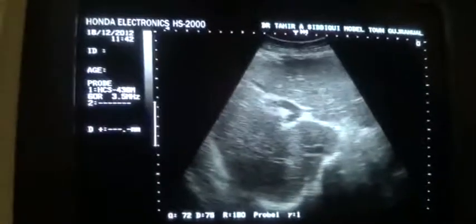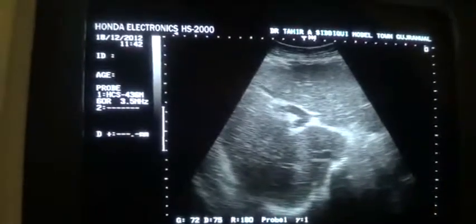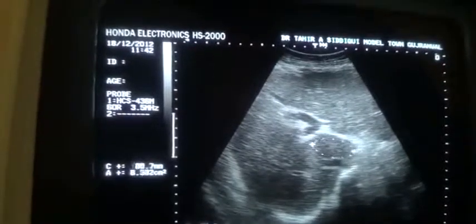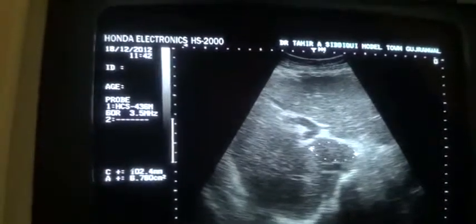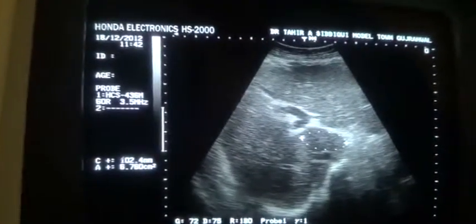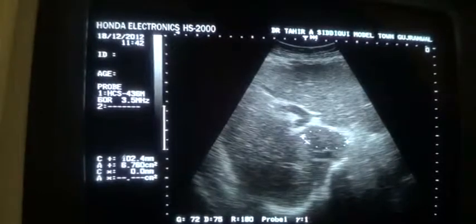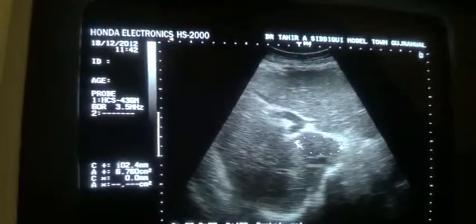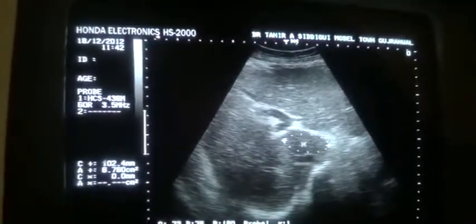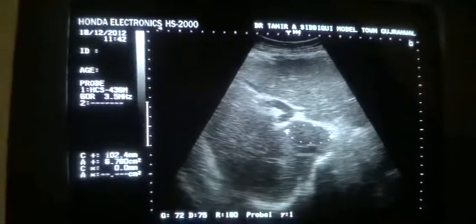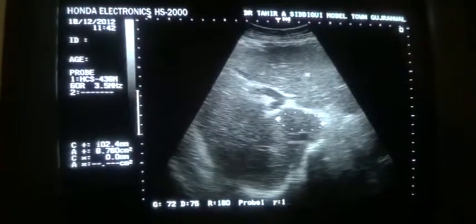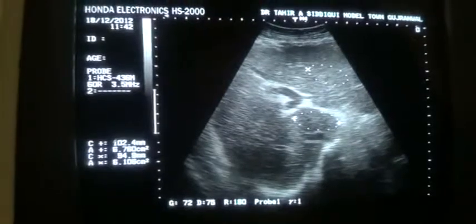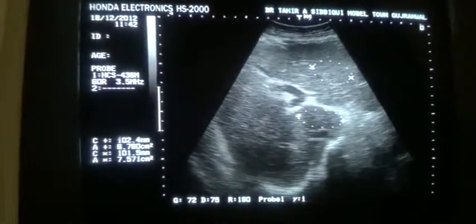This is the ligamentum teres, this is the IVC, and this is the caudate lobe of the liver or segment one. Remember that the echogenicity of the caudate lobe is really preserved in cirrhotic liver, because the caudate lobe has its own separate blood supply. Now you can see that this is a cirrhotic liver.